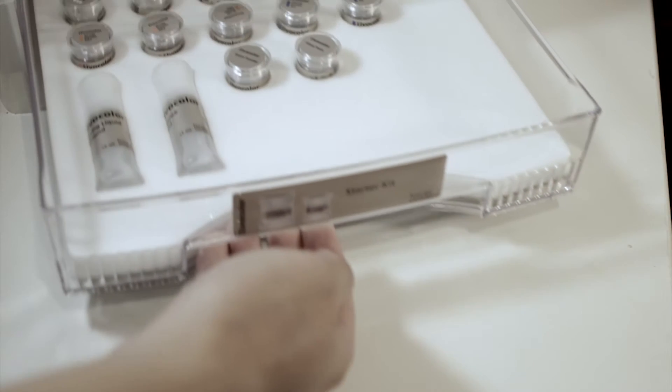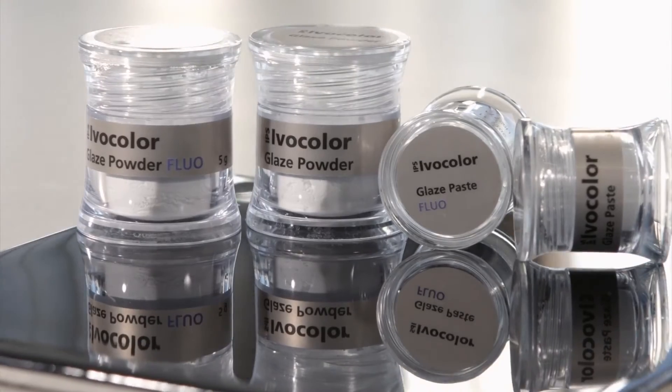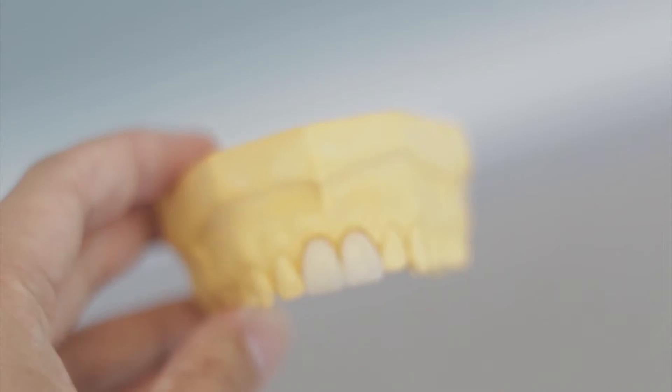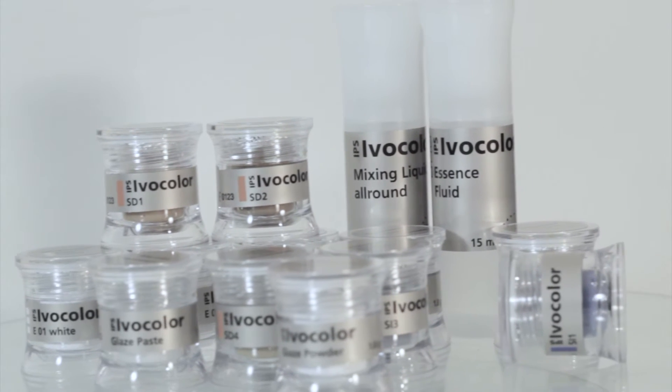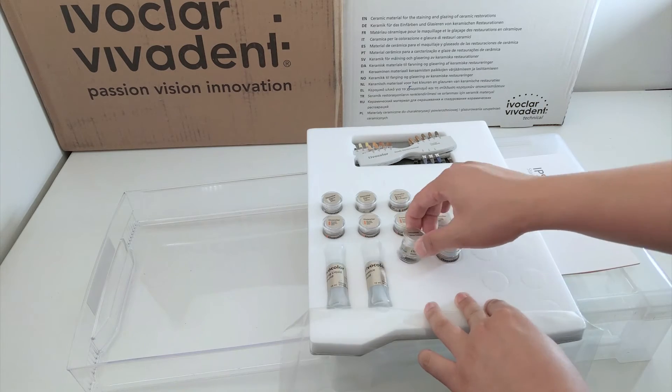Straight out of the box, you can tell that the development team really put a lot of time and effort into the product. The ultra clear, glass-like finish of the jars hint at the translucency and clarity achievable by the final product. It has no bearing on the product itself, but the thoughtfulness and craftsmanship are a nice treat for those who are sticklers for packaging.